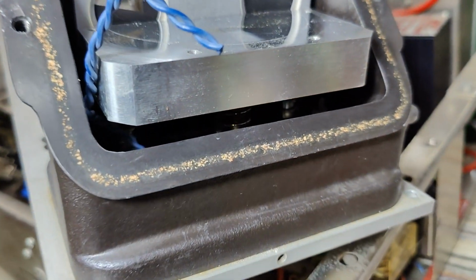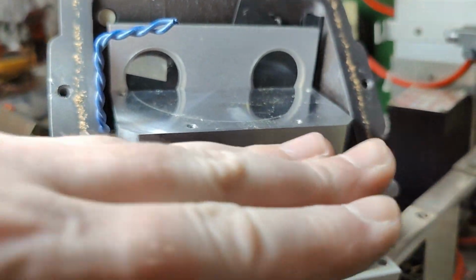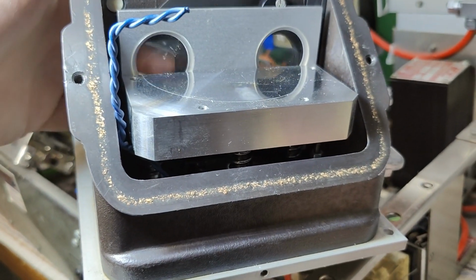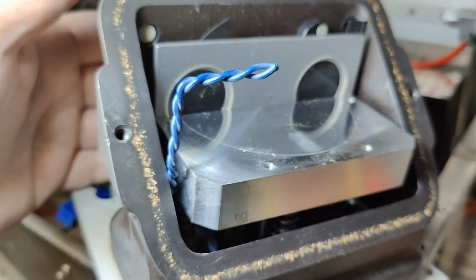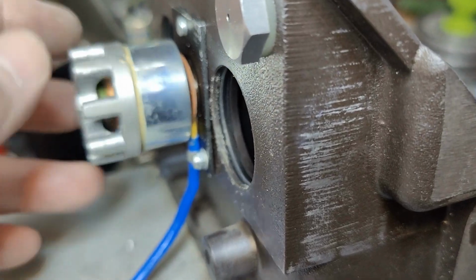I try to lift it as much as I can to try and show this, but there's no way I can get in there easily. But that is what is going on for some final super timing adjustments, and because of this little shutter thing. And by the way, this motor is a 3-phase motor and it's super good with the bearings.